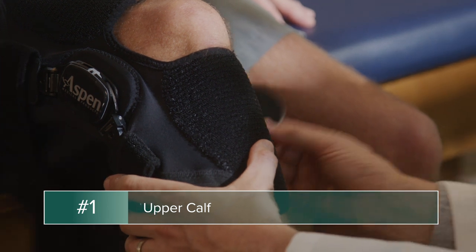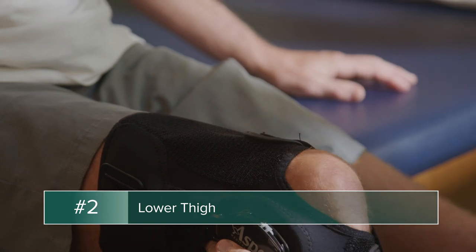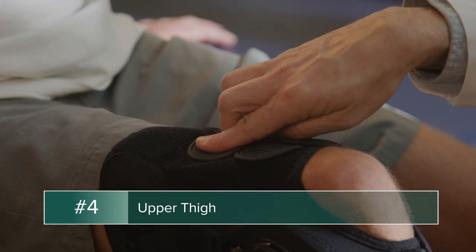Begin with the number one strap on the upper calf. Proceed with the second strap on the lower thigh, the third strap on the lower calf, and the fourth strap on the upper thigh.